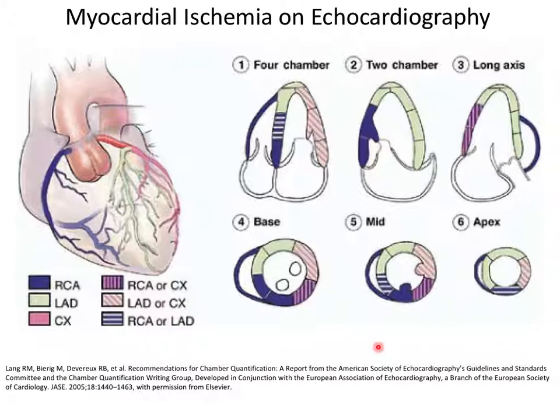This map, with the abnormal contraction and the EKG from the patient, if the EKG is showing abnormal activity, abnormal voltages, oftentimes the structure of the EKG can also tell you where the ischemic region is on the heart. And so it will be an additional clue as to which vessel is causing this ischemia.